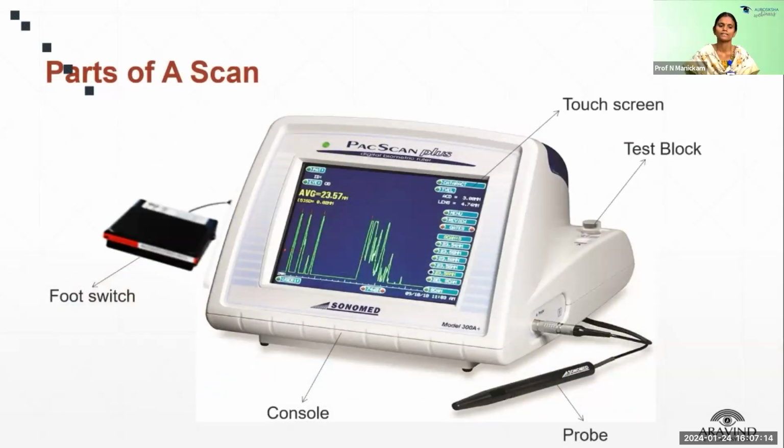Parts of A scan. Console: it is an interfacing unit to control the working of the A scan machine. Probe: this is a very important part of the A scan machine. It transmits and receives the ultrasound waves. It has an LED for fixation purpose.